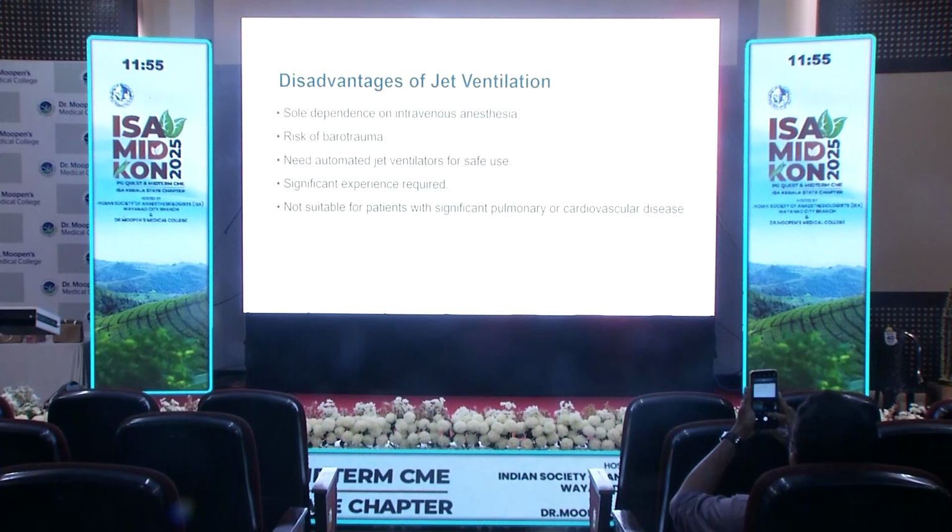The disadvantages include sole dependence on intravenous anesthesia, a risk of barotrauma, and we need automated jet ventilators for safe use, and significant experience is required for safe use. It is also not suitable for patients with significant pulmonary or cardiovascular disease.